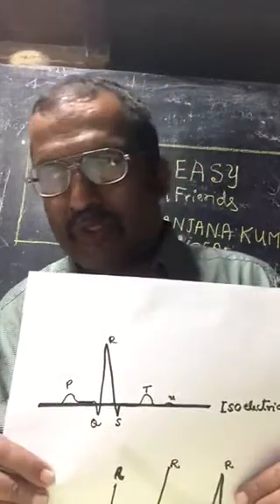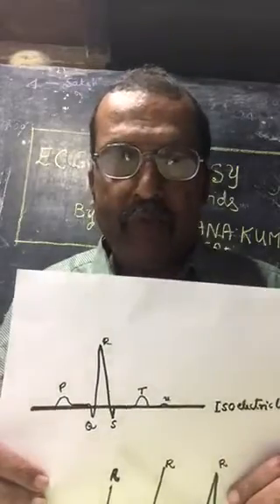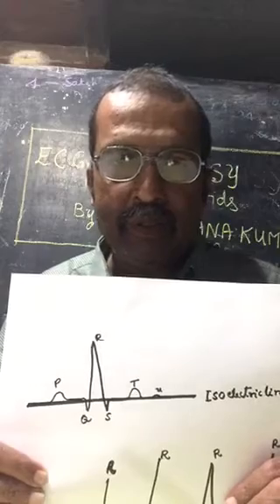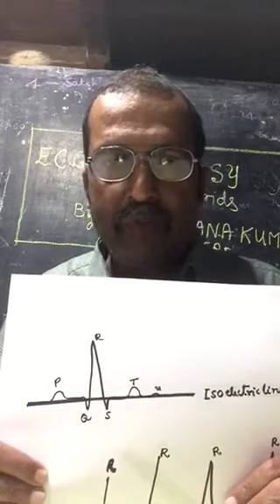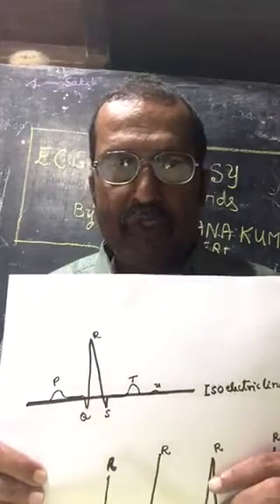After 6 hours of the initial ECG, you should take one more ECG. If it has responded to treatment, there will be T wave inversion.